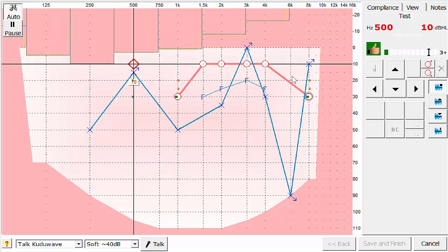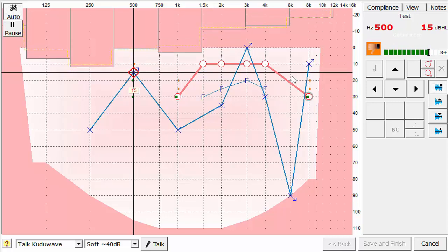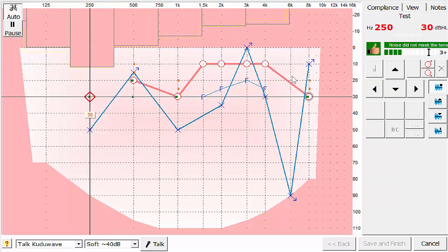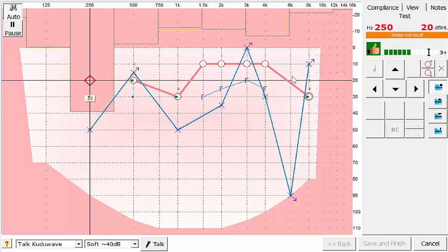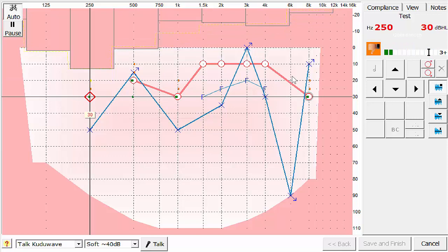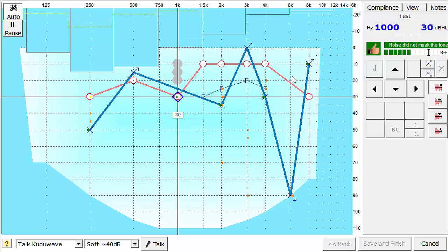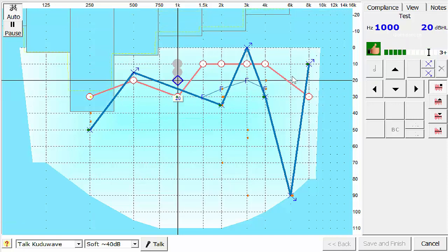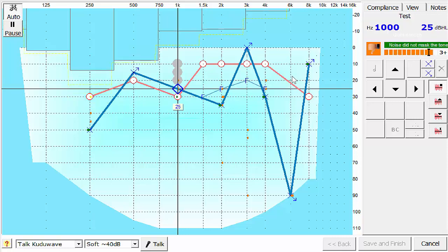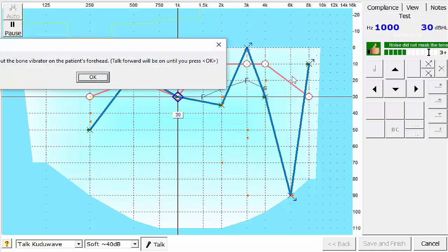The benefit of that is during that time you can organize yourself, making sure everything is fine. By the time the bone conduction starts, you might take over manual bone conduction. You might decide to continue with automated bone conduction, and after it is finished, you decide, let me repeat some frequencies so that I feel comfortable. If I press a button, it jumps over to the bone conduction, and in this case it will continue with air conduction. It will repeat air conduction. The first threshold presented will be presented again at the end. There you are, and the test will now be finished.